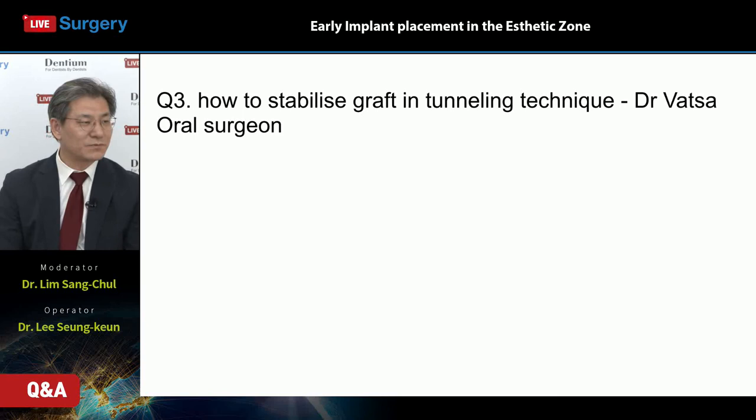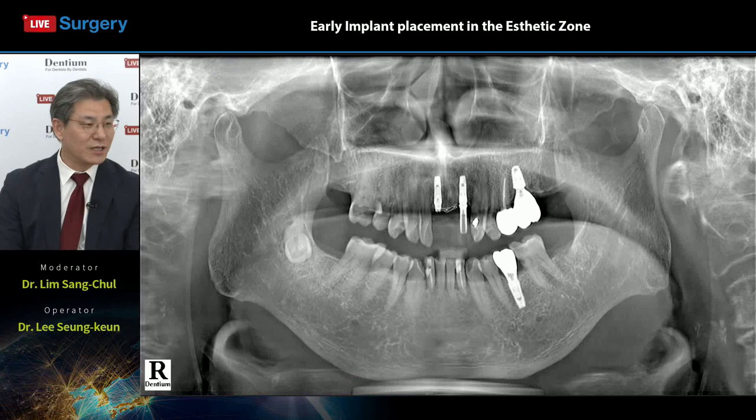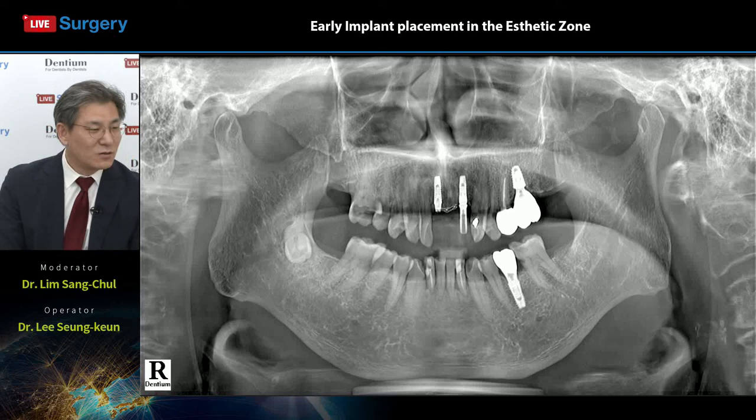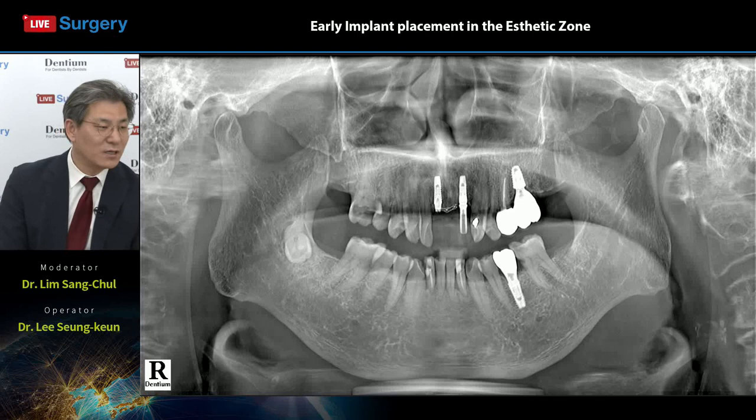So let's move to the panoramic view after surgery. Okay, can you see this number 11 site? Very nice. A well-installed implant fixture, good direction and parallel to the already installed number 22 site implant fixture. And what about the depth? The implant installation depth is very good, because I already mentioned 3 millimeters from the CEJ of the neighboring natural teeth, right? So very nice and well done. The proper vertical position.